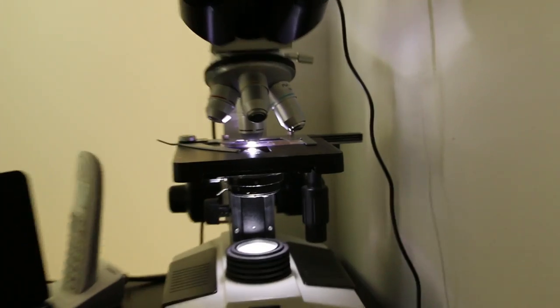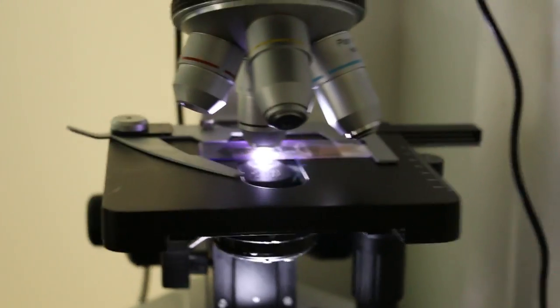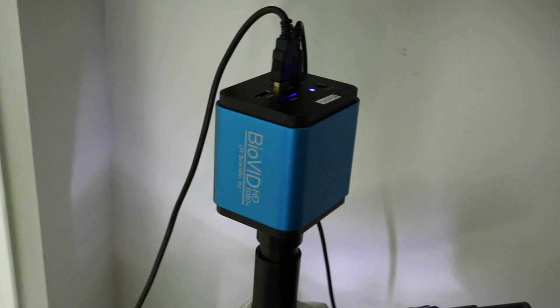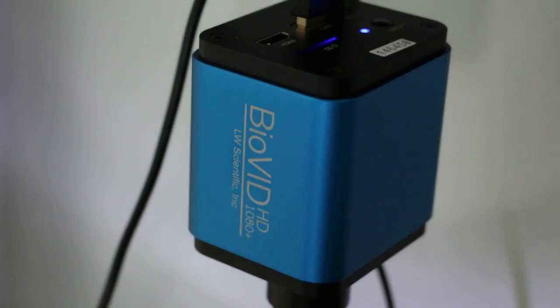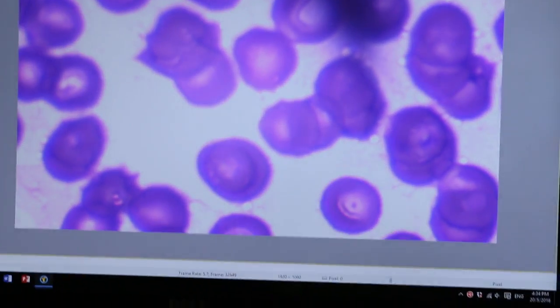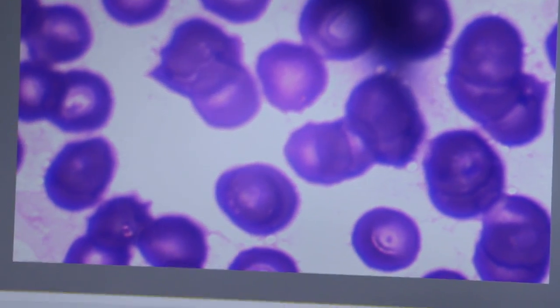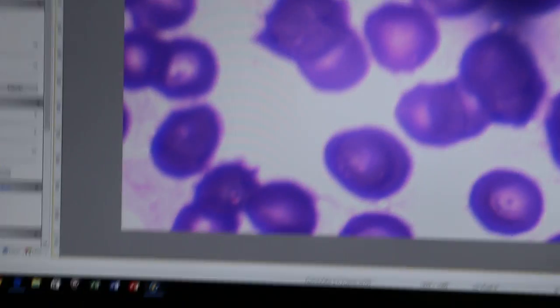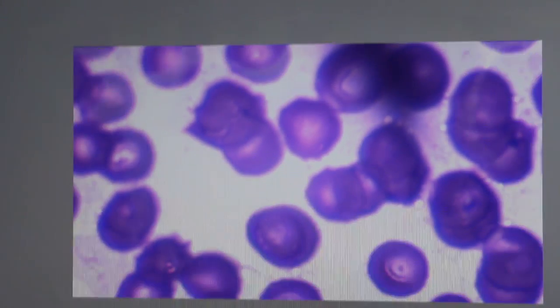Some books say take the ear vein, take the blood from the ears, and all depends on the period, the incubation period. On this camera, this microscope, you can do a video as well to show it to the owner. Otherwise, just capture images with your handphone and send it to the owner or show it in front of the owner, because this one you can magnify. You can magnify it.